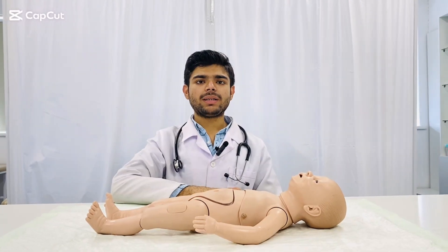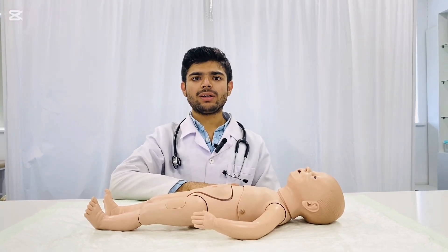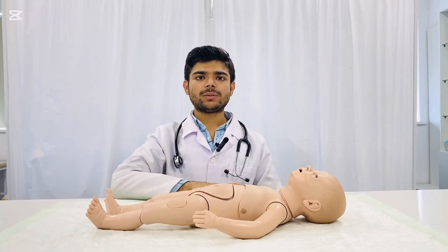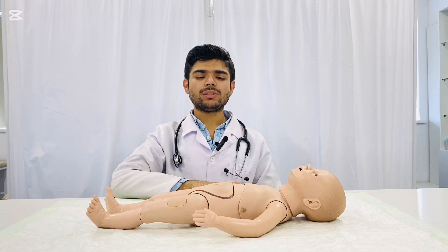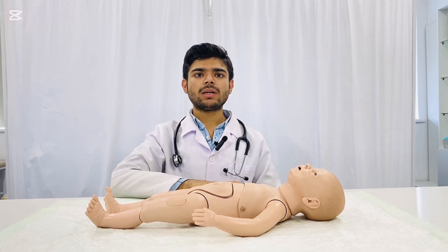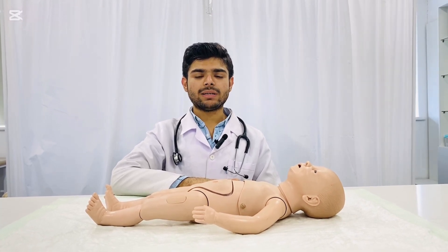In the greatest name of Almighty Allah, who is Rahman and Rahim. Welcome back to Dr. Najm Lectures. In this video, we will perform auscultation of lungs in infants.